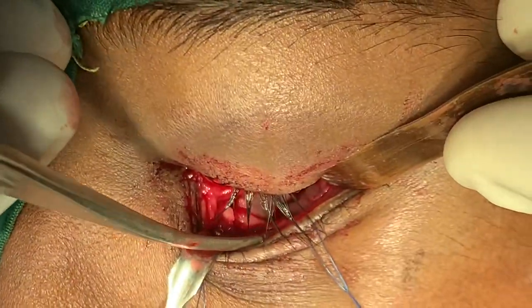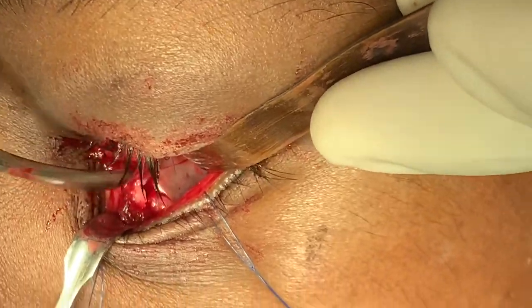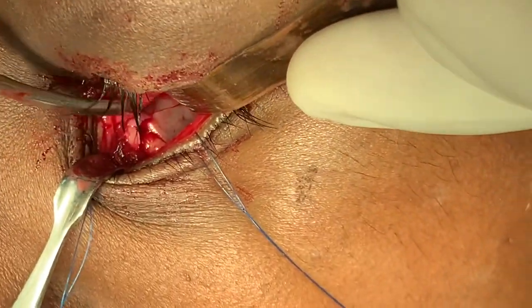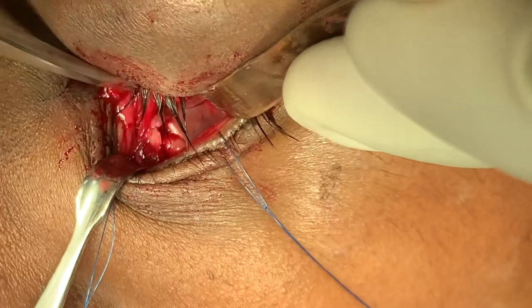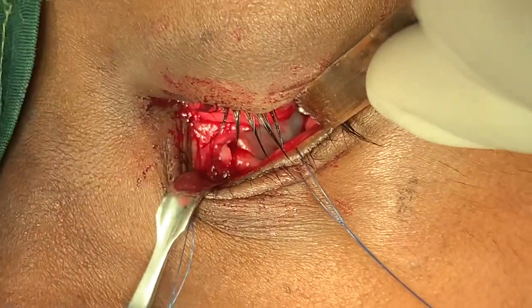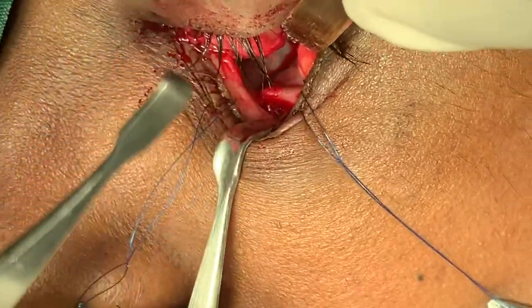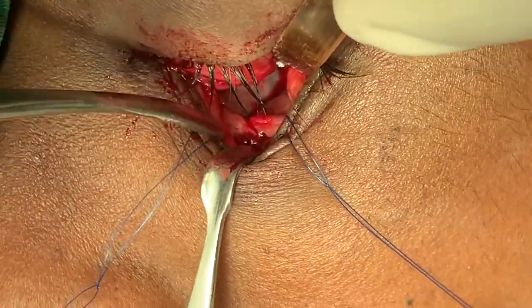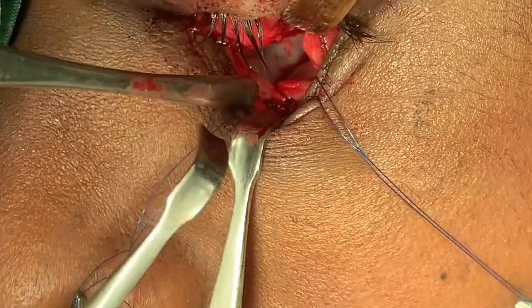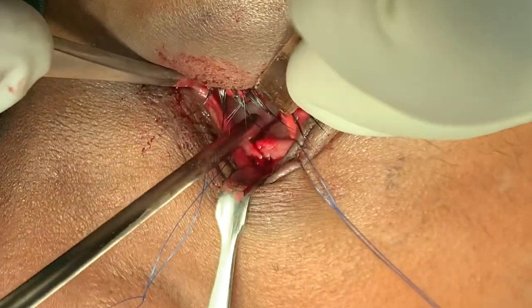So I've exposed the entire fracture now. I'll show you in a moment. So suction. Hope you can see it. This is moving. You see that the orbital floor, and this is the other end of the fracture. Put this here, please. So that's one end of the fracture. This is the other end of the fracture. And that's the posterior limit of the fracture on the floor.